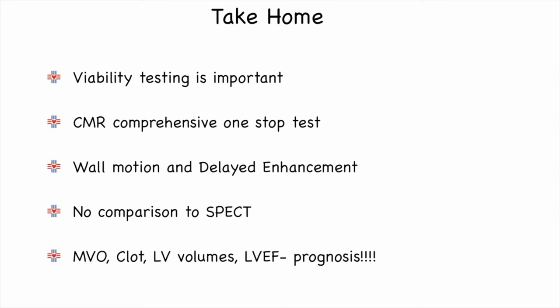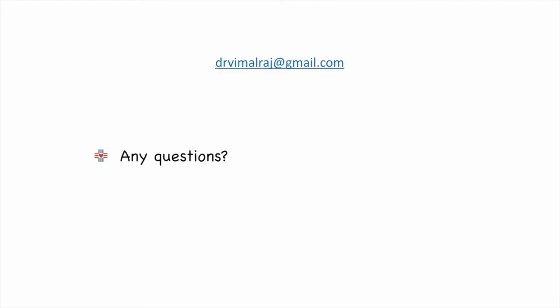Wall motion abnormalities and delayed enhancement are the techniques used for assessing viability. There is no comparison of MRI with SPECT, with MRI being far superior for assessment of viability. Microvascular obstruction, LV volumes, and LV systolic function are important prognostic features which would be helpful in improving patient care.